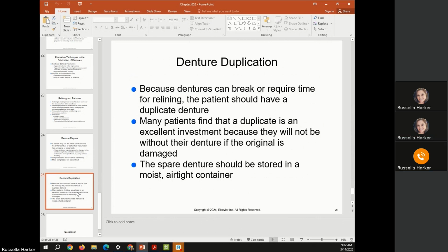At the third appointment, you try in the base plate and the occlusal rim, and then we look at the vertical dimension, which is the space occupied by the height of the teeth in normal occlusion. So we want to see how high the teeth are. We want to look at the occlusal relationship, the centric, protrusive, retrusive, and lateral excursions, how the teeth move in all directions.